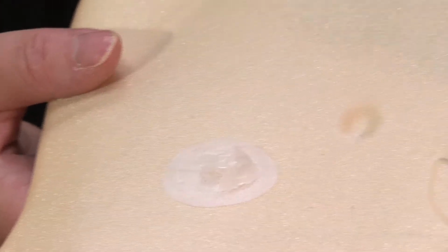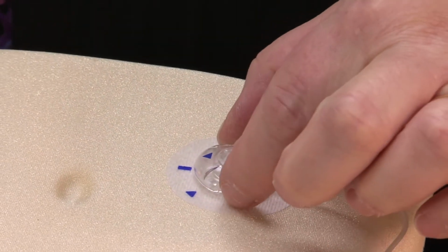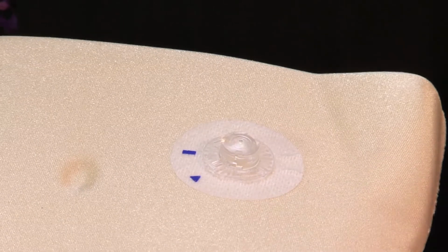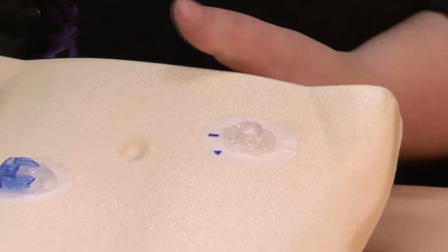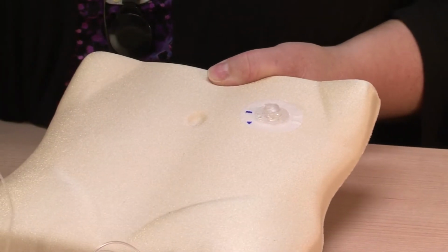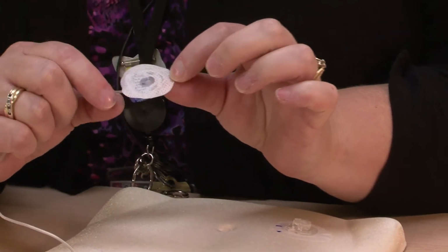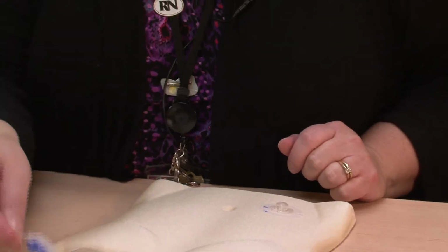The other may have something that looks like this. I kind of think of this as like a button. If that's the case, all you're going to do is twist and line up the two arrows and pull it off. The patient's no longer getting insulin. Something else that you could do, let's say you're fumbling, you're not sure, really, all you have to do is rip it off. There's no needles. There's only a plastic cannula that's inserted in the patient. It's the same thing as taking off a Band-Aid.